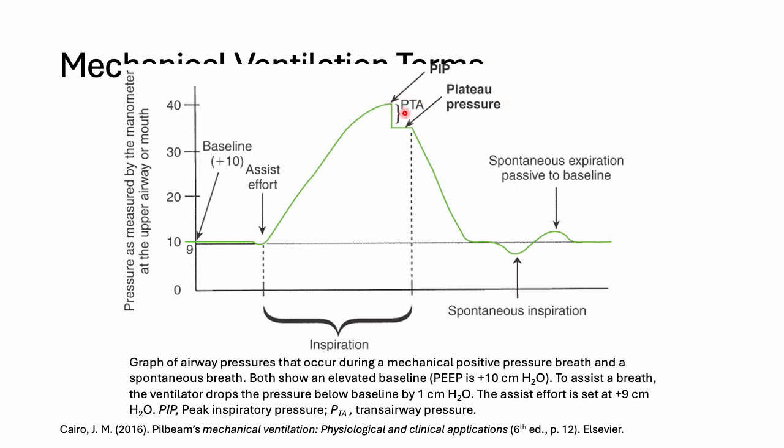So back to the two slides before, yeah? Peak pressure equals the pressure that is required to force air through airway resistance, which is the trans-airway pressure, as well as the pressure that is inside the lungs, in this case, the plateau pressure.